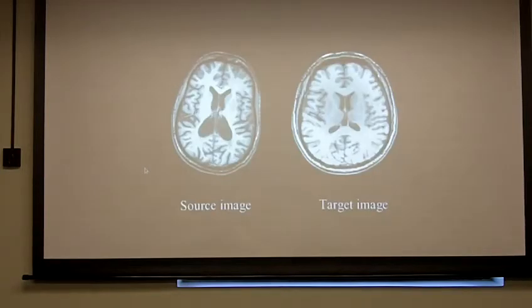I have a quick question. Yes, please. So I know Dan a second ago was talking about affine transformation using Voxpo. I know your method is to use ants. So essentially just using two different programs to do the same transformation here. Is this fine? Because I know you can use ants to do the entire registration process, but is it fine to go with either method here?